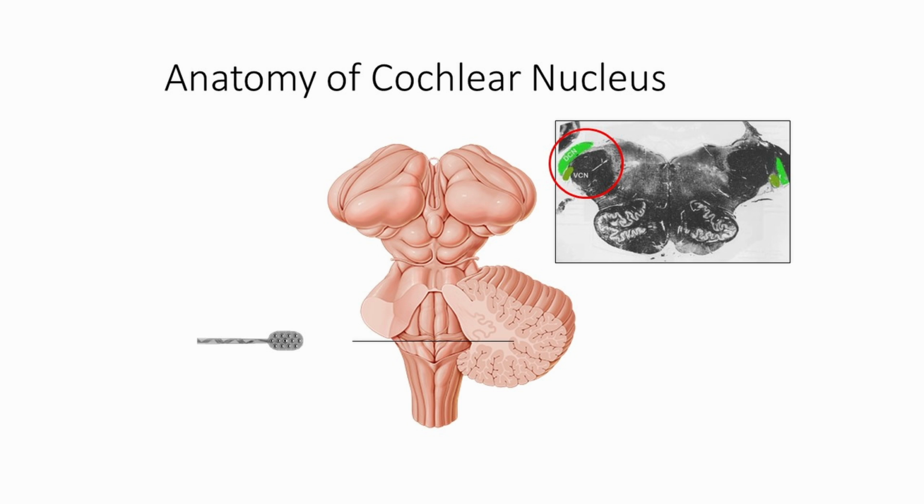Next slide, please. Oh, I'll just press it again and it shows you a little bit of graphic. Yeah, next one. So it basically goes into that hole and stimulates the cochlear nucleus from there. Okay, next one, please. And this is just a video again.